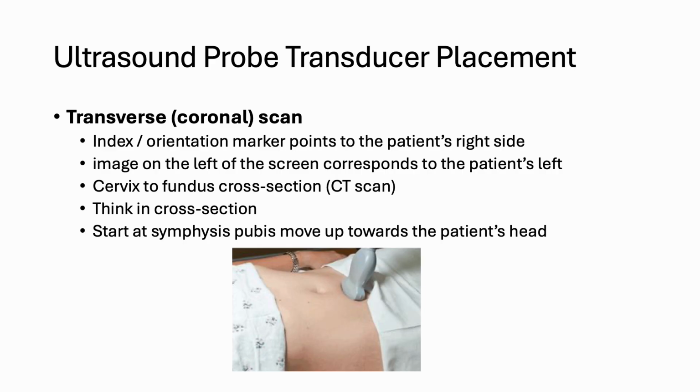When you look at this, you will see the cervix to the fundus, and it will cut in cross sections, kind of like a CT scan. So you're going to think of things in a cross-section view. You'll start at the symphysis pubis and move upwards towards the head.